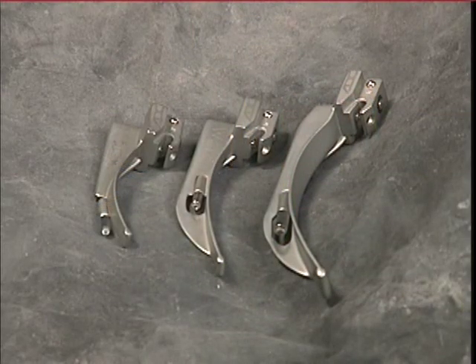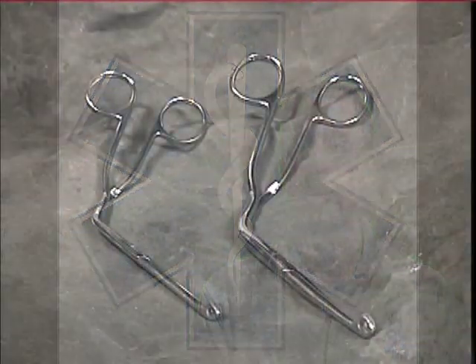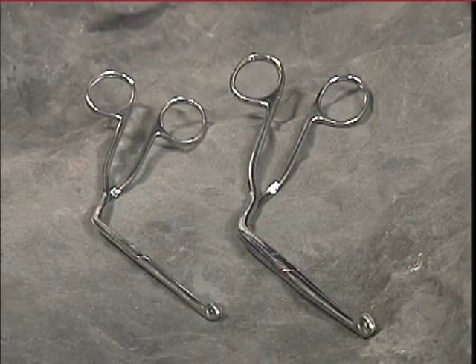Both types of blades are used by advanced life support providers during intubation. However, at the BLS level, the curved blades are the ones that are to be used for foreign body removal. The McGill forceps comes in various sizes as well, larger for the adults and smaller for the pediatrics.